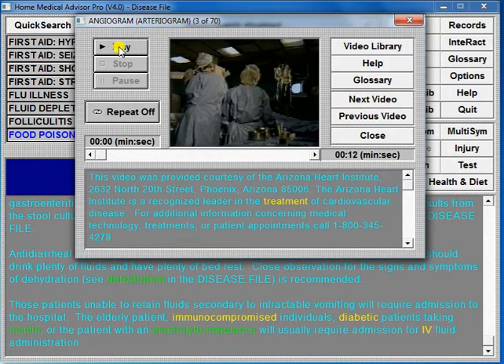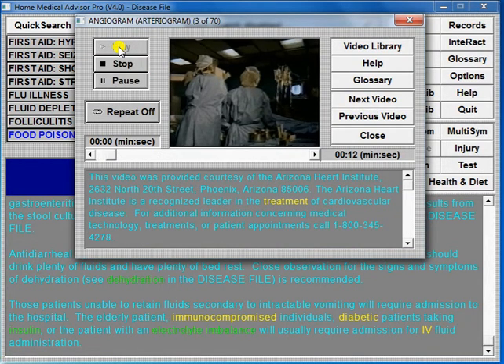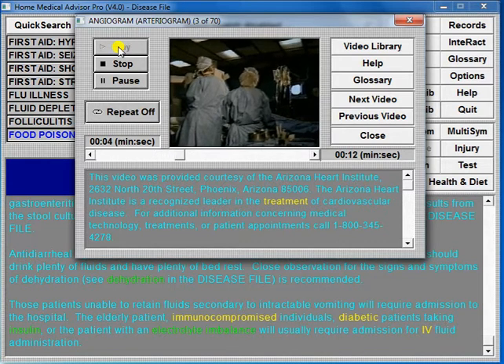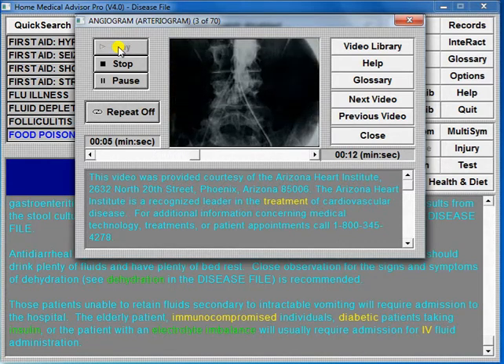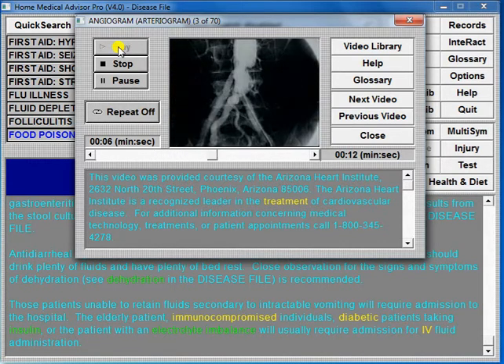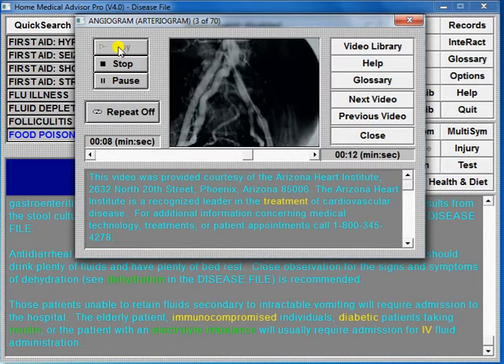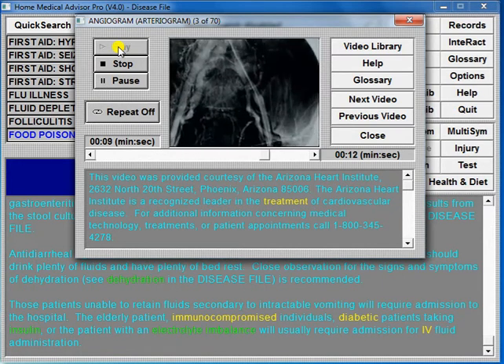To image smaller arteries, dyes and x-rays provide the most accurate intelligence. At the Arizona Heart Institute, specialists perform an angiogram of the major arteries to the lower extremities.